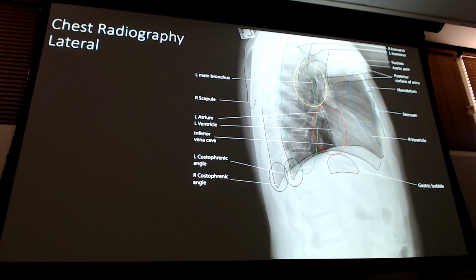Why? Well, because when I'm shooting the x-rays from the back, right, and I'm hitting where these posterior costophrenic angles are, where lung tissue is, look at what's penetrating after this. All this stomach and soft tissue and organs and liver, it's absorbing all that radiation, right? X-rays come in from here, they hit here, great, there's air, but now I'm absorbing it all.